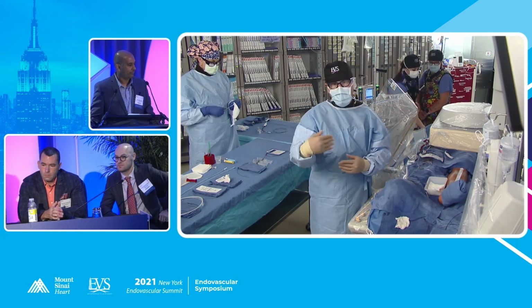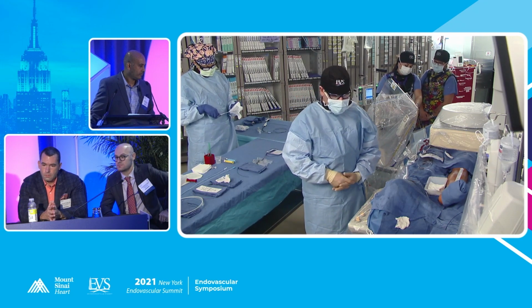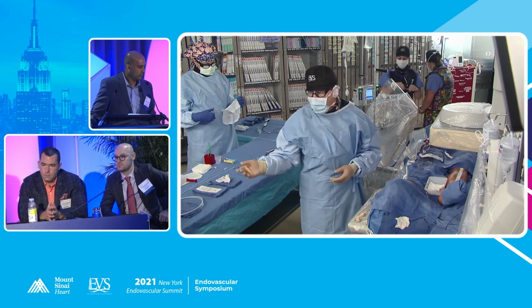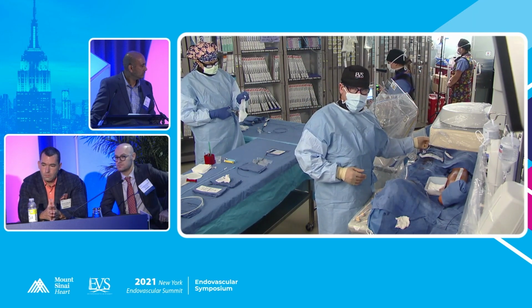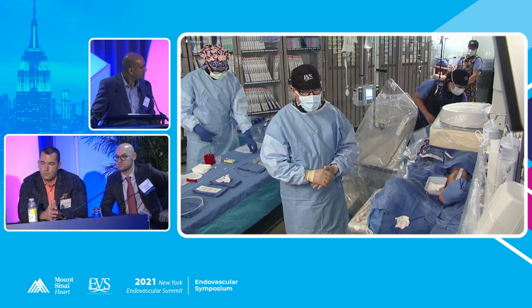And there have been times where we shockwave the profunda and the common femoral artery into the SFA, obviously after careful vascular team consideration. So here I didn't think we needed to. Big profunda, the disease actually ended just before the bifurcation. I felt very confident we could wire it again. Accessing 4 months later, with good vascular ultrasound here and an ultrasound before we came in, and relief of symptoms in a 4-month procedure, I was okay with it. Peter?